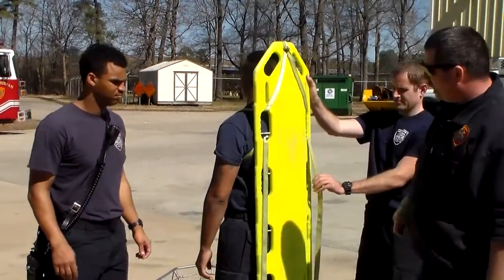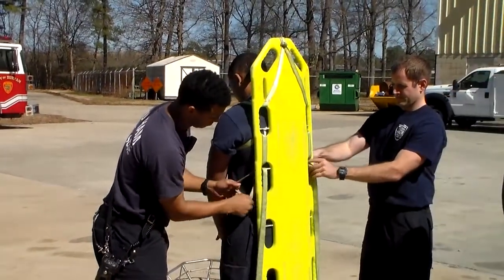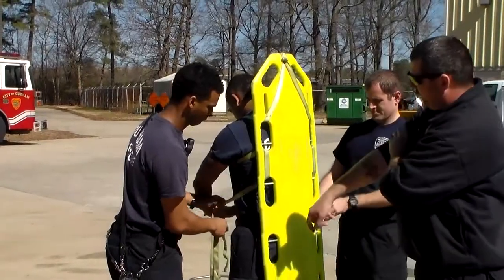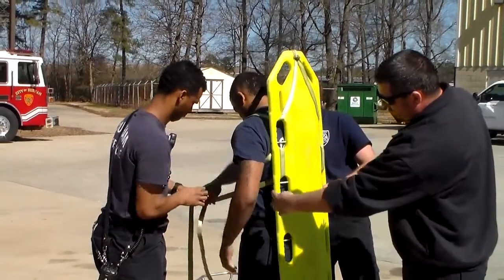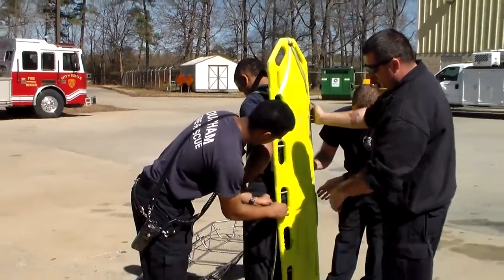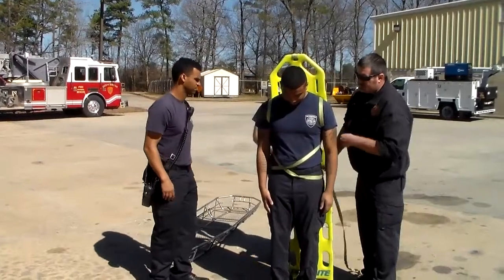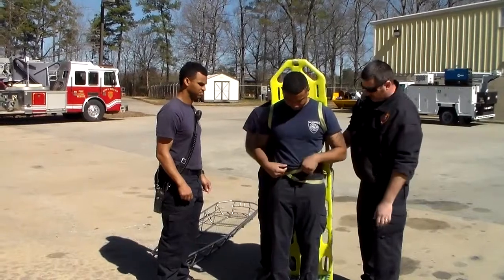We'll then come down to the next port, again staying away from our pins. We'll push it all the way through, and once that comes through we're going to crisscross across their front. You'll crisscross around the front and drop down to the very next hole. Across the front is going to look like so — he's got his shoulders here, and that's going to keep him from sliding up and down the basket. We're starting to crisscross as we go down.